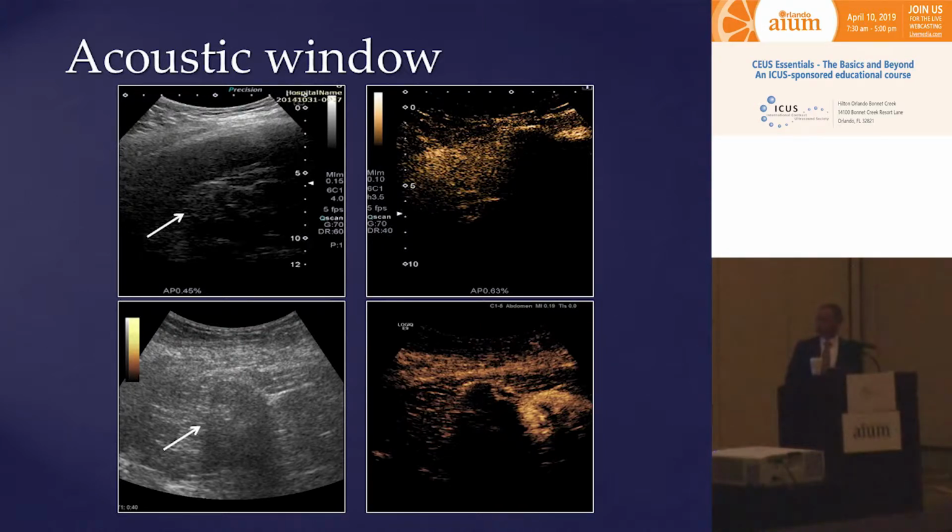Kidney with a large tumor that was ablated with microwave ablation, you can see when it's close to the skin, you can see nicely dark void area of ablation cavity, nicely enhancing kidney.